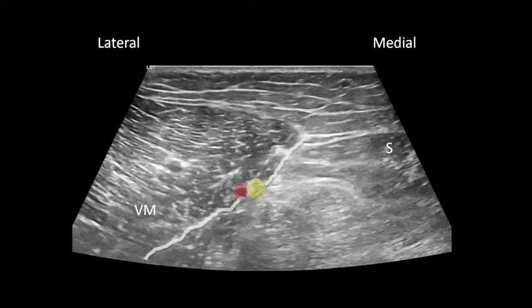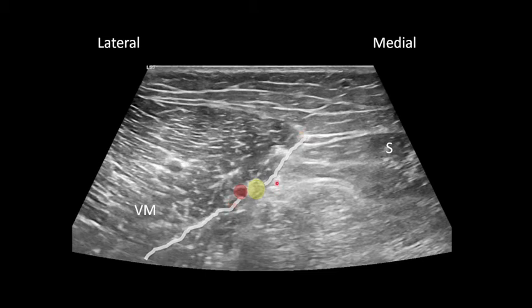As you scan through the medial distal thigh, you'll note a large muscle body on the lateral side — this is the vastus medialis. A fascial plane, highlighted in white here, will separate the vastus medialis from the sartorius muscle. In this fascial plane, you should identify the nerve-vascular bundle. Color Doppler may be useful in this region to identify the artery. The saphenous nerve is highlighted here in yellow.